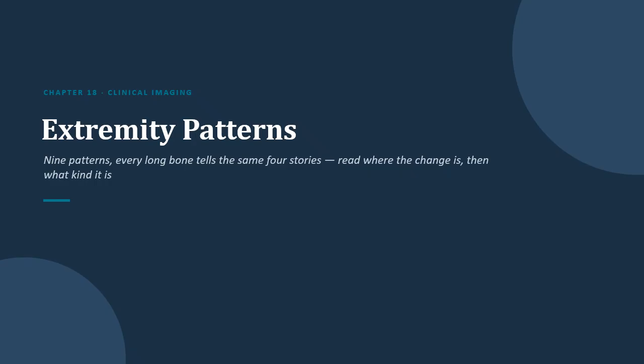Just like we did with the spine and the skull. Again, we're not trying to memorize these diseases, and we're not even trying to make a diagnosis, but we do want to know what abnormal looks like, what normal looks like, and sometimes we might be curious about what is actually going on. So when we see something abnormal in a long bone, we should start thinking about where it is, and also what the bone is actually doing.